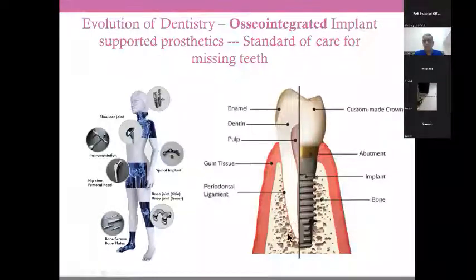Just as the root is there in the bone, in our jawbones we are surgically, with a very minor procedure, placing these titanium screws inside our jawbone to act as an artificial root, to act as an artificial pillar, to act as a support for our artificial tooth or prosthesis, which is going to come on top. And there is an intermediary component also called an abutment, right?